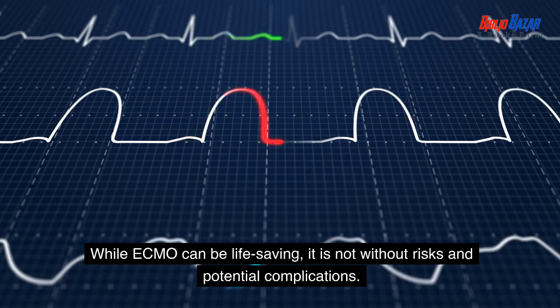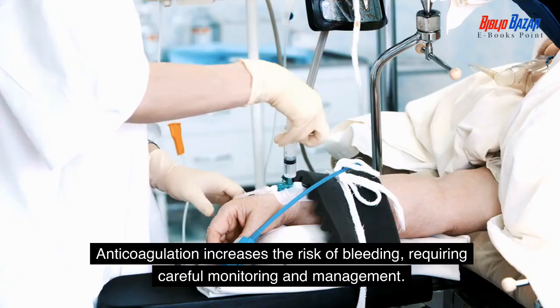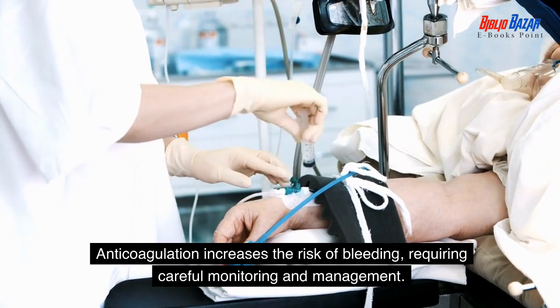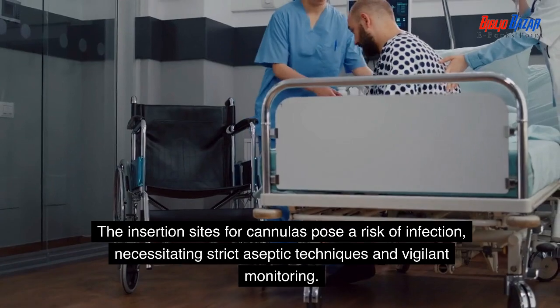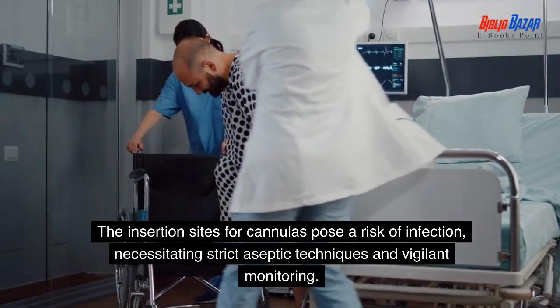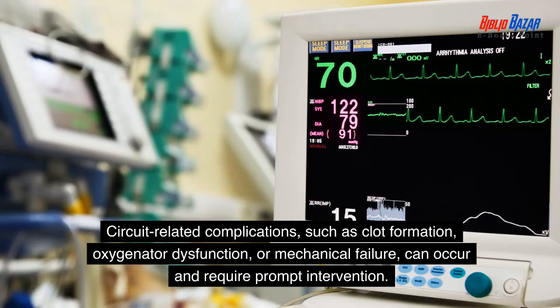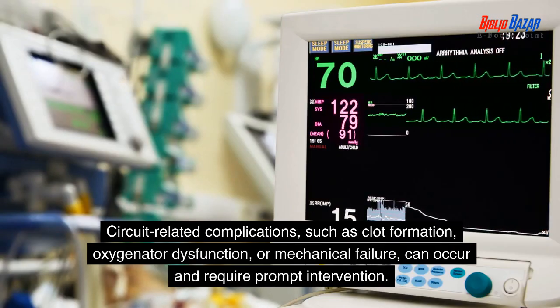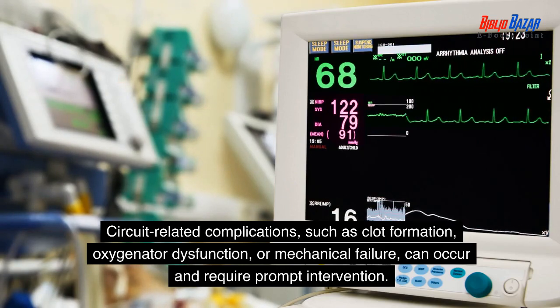While ECMO can be life-saving, it is not without risks and potential complications. Anticoagulation increases the risk of bleeding, requiring careful monitoring and management. The insertion sites for cannulas pose a risk of infection, necessitating strict aseptic techniques and vigilant monitoring. Circuit-related complications, such as clot formation, oxygenator dysfunction, or mechanical failure, can occur and require prompt intervention.